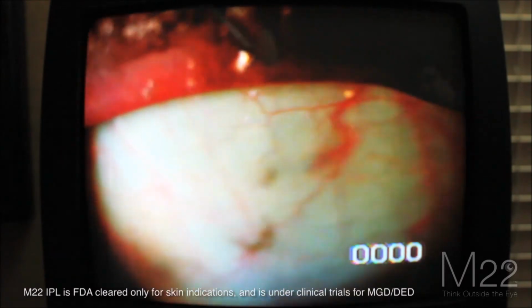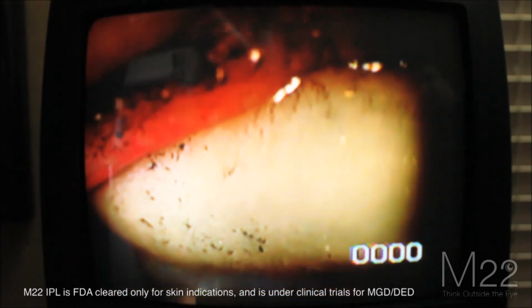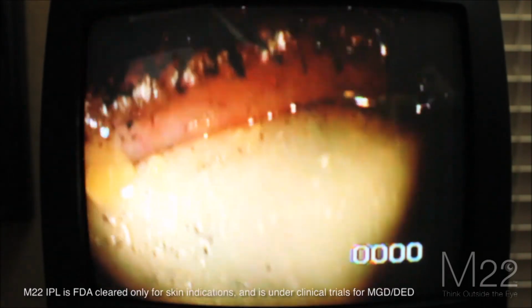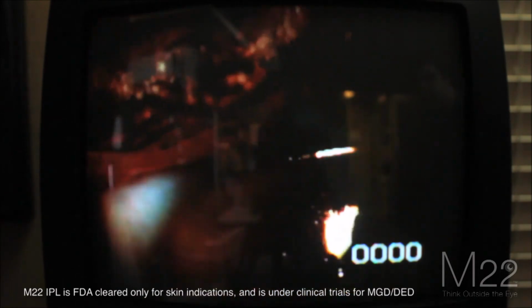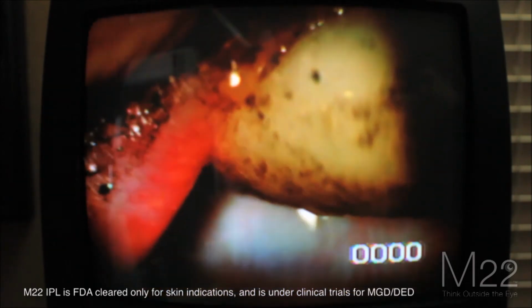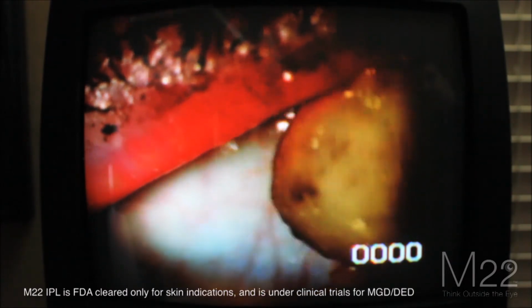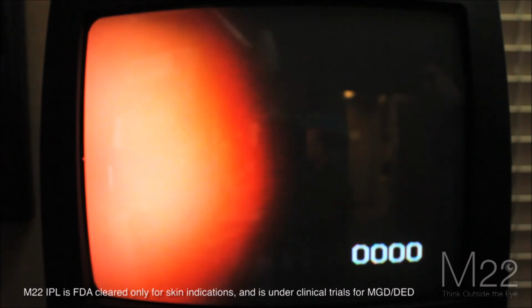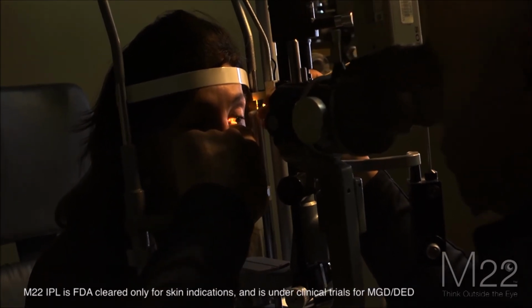Now, I'm pretty vigorous the first treatment because I want to get as much of this toothpaste-like secretion out as possible. So you just see all that toothpaste that's in the glands. That's completely abnormal. So you can see why she suffers from some dry eye. Look down. You can see all that toothpaste that's coming onto my Q-tip. So patients, when you're doing this part, they're going to want to blow their nose. The reason being is all this abnormal secretion is draining into their nose.